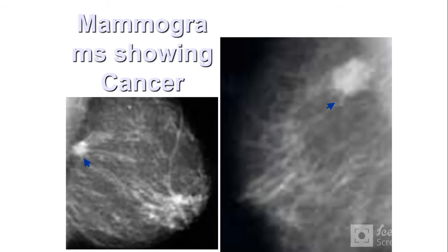These crystal white areas are cancerous. When the lump is not superficial and is close to the pectoralis major muscle, close to the bone and close to the chest wall, we can't evaluate it through palpation. So we do mammography. These are the pictures of mammography.